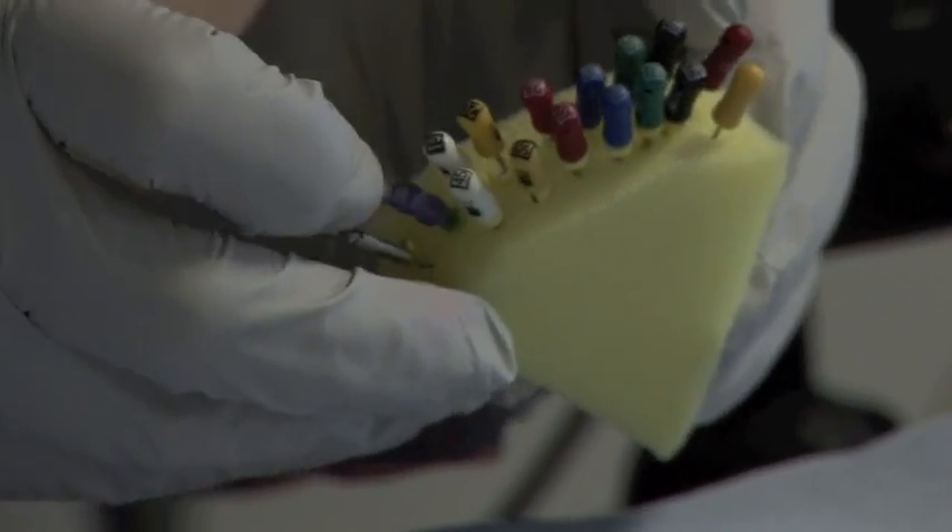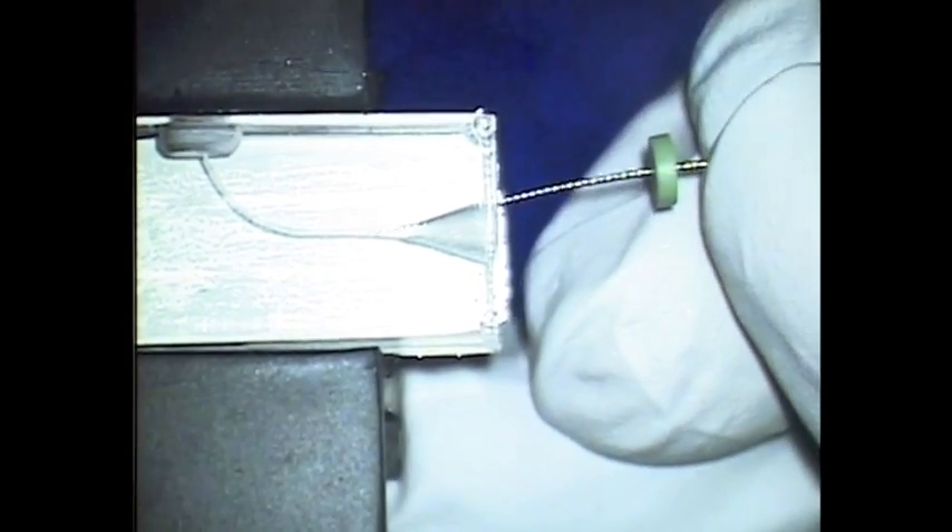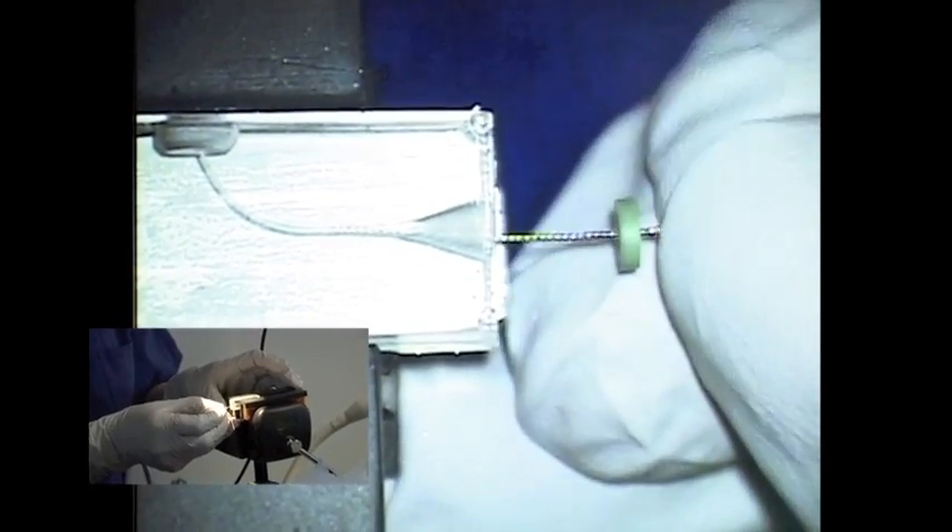I'm going to take a size 10 K-flex file and feel down the coronal third of the canal. You can see here I'm just looking for any interferences.